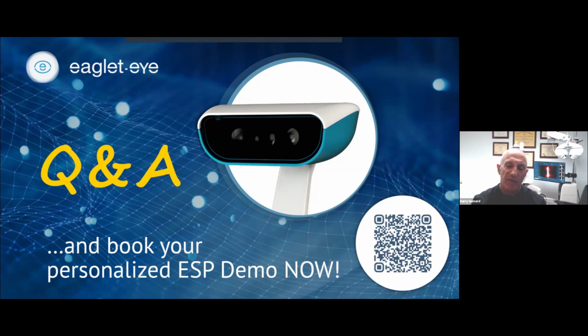We all try to empirically fit these other lenses, and I do try to train other doctors and my interns how to fit an elevation lens, for instance, without profilometry, and you can get somewhere. You're never going to get all the way as we do with an Eaglet.